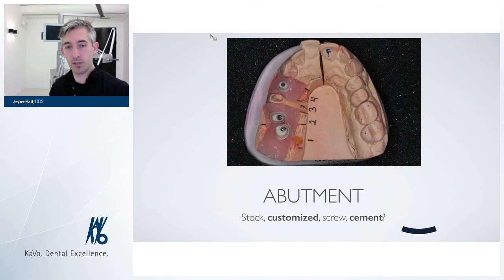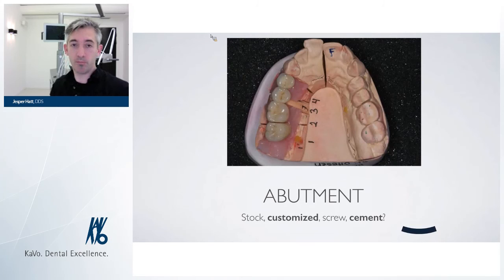We took our impression, and our technician made us these titanium zirconia abutments. They still hold up. I really like the soft tissue, how it looks around the crowns. It was really easy to remove the cement. If I just pushed a little bit on the soft tissue, I was able to see the junction between the crown and the zirconia abutment all the way around the crown. That way I could really be sure that I removed everything. My technician did a wonderful job in consideration of how difficult the implants were placed.